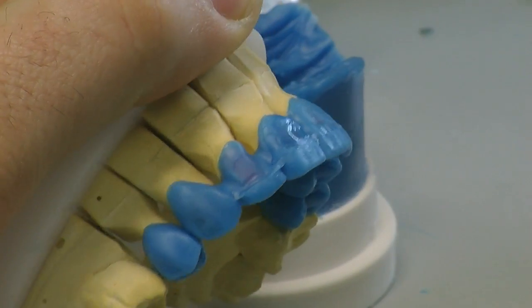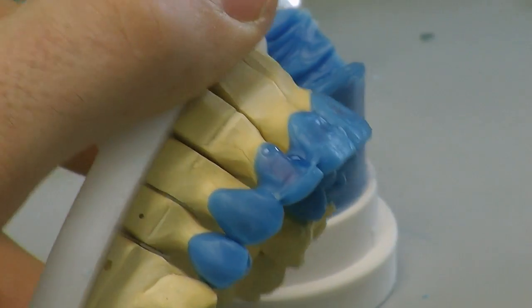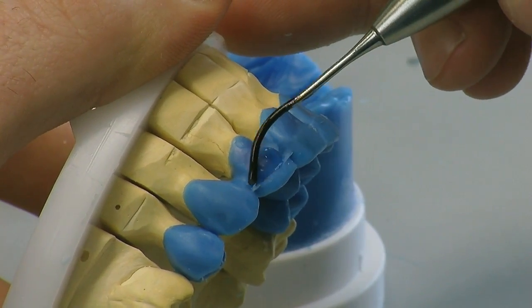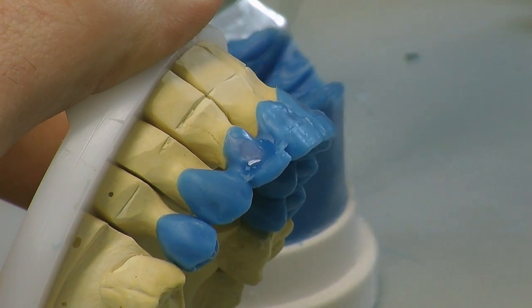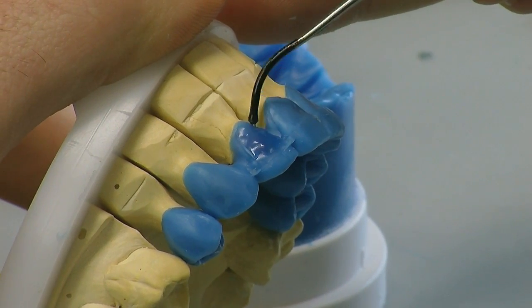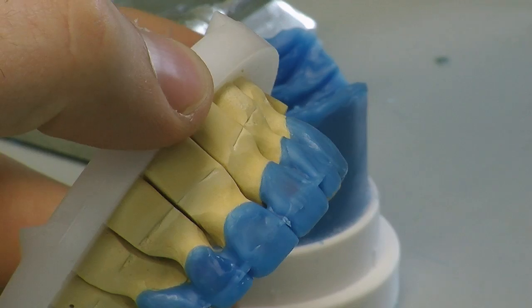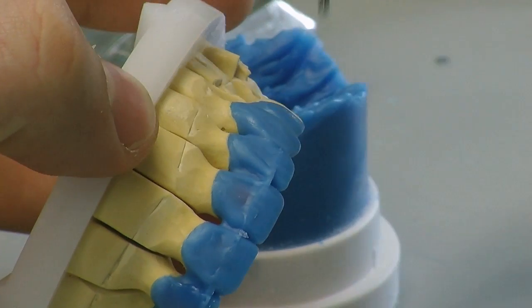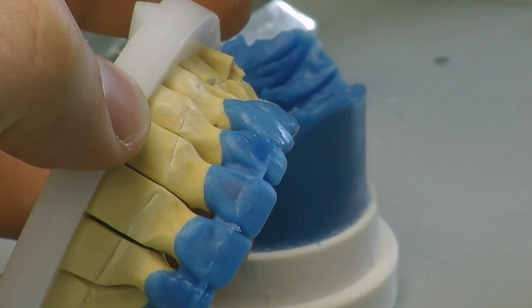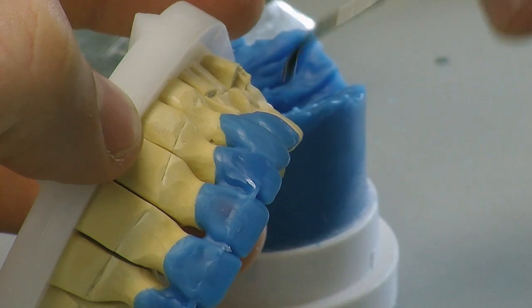Works every time. The interesting part about this system is it can't be wrong, because if you have a putty of the patient approved temporary that the patient has said, I love this smile, and you have 3-point contact on that model, you've verified that your model's very accurate, you know that the putty is going to be spot on. As soon as those two go together, you can actually see from the inside where it just fits beautifully around the tissue and around the tooth stops.